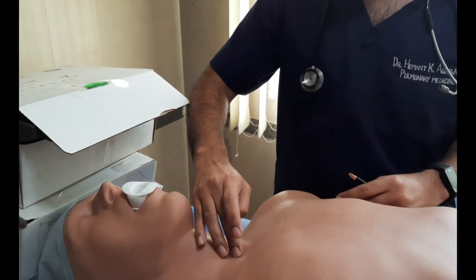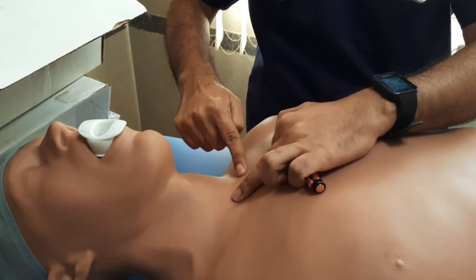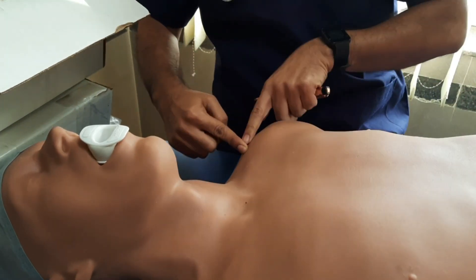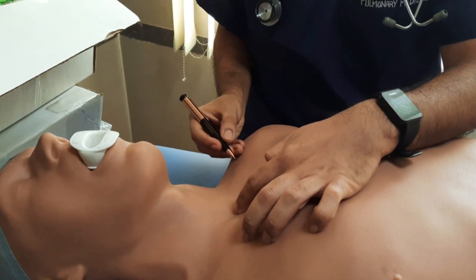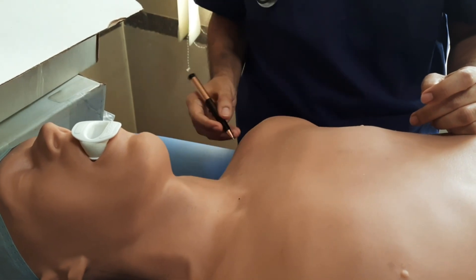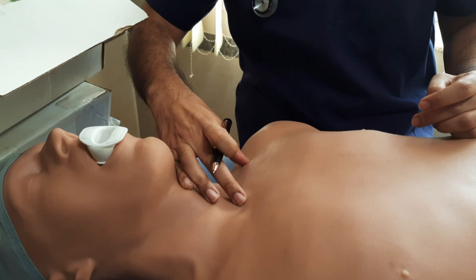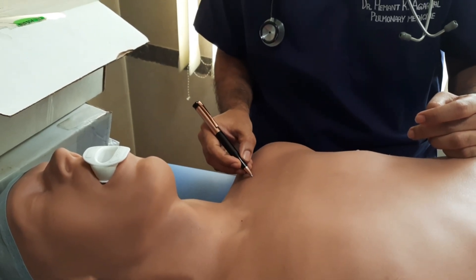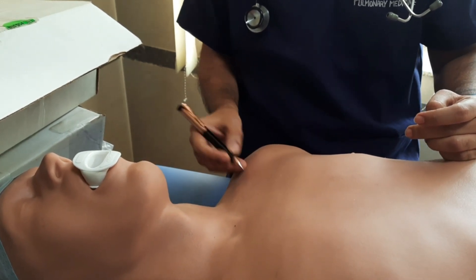We will keep a finger of our non-dominant hand in the supra-sternal notch and trace the clavicle to its end. We will divide the clavicle into three parts: medial one-third, middle one-third, and lateral one-third. At the junction of the middle two-thirds and lateral one-third, one centimeter below this point is our central line insertion site.